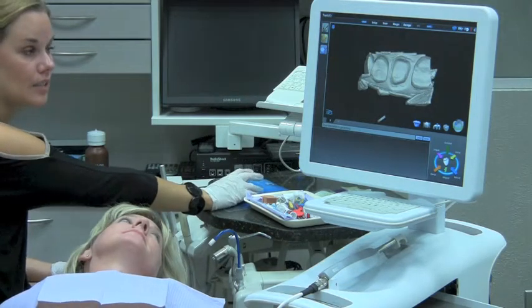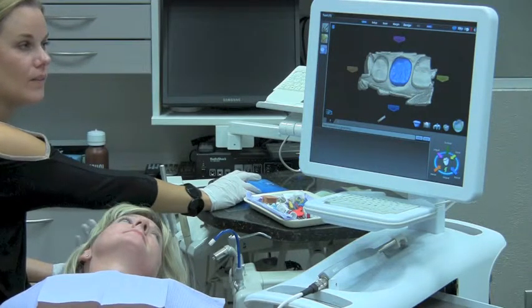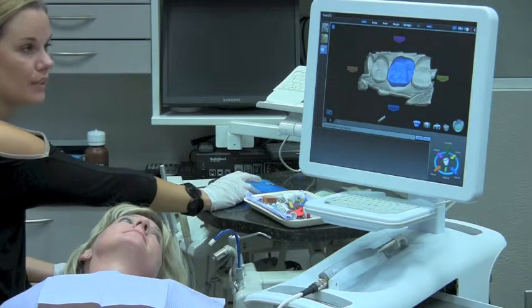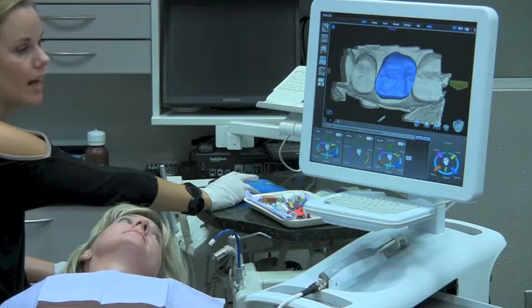When I go to design, I'm going to see the library tooth drop on there — which I chose Lee Culp's Library of Anatomy. That tooth is going to drop on there and then morph to match the neighboring dentition, looking at cusp height, marginal ridge, minimum material thickness, contact, and occlusion to give me my initial proposal. This is my initial proposal and I'm pretty happy with that.